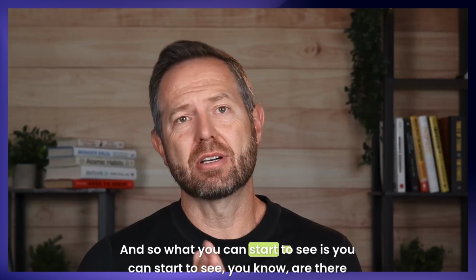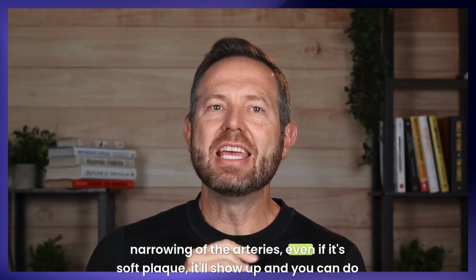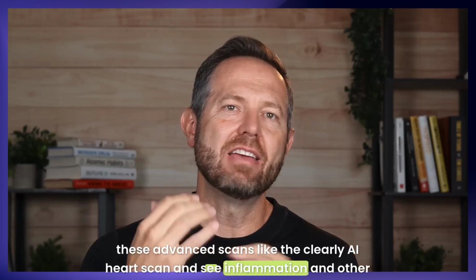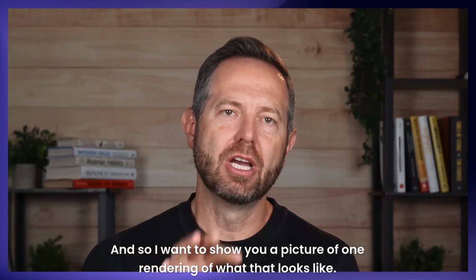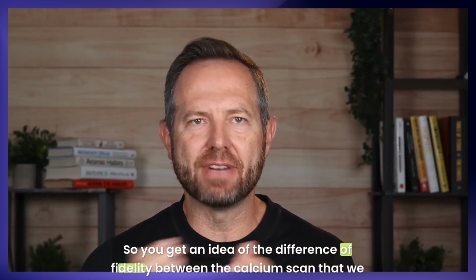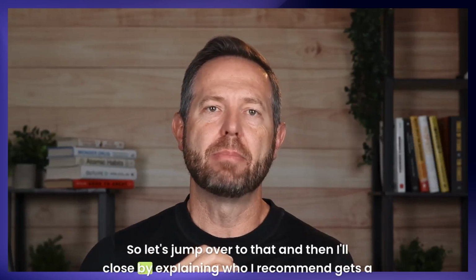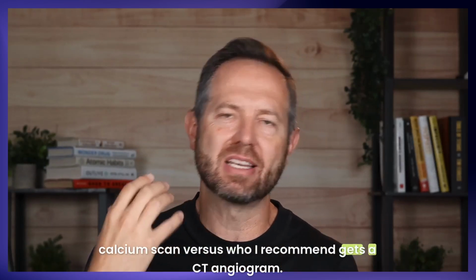And so what you can start to see is, are there narrowings of the arteries? Even if it's soft plaque, it'll show up. And you can do these advanced scans like the Clearly AI heart scan and see inflammation and other soft plaques in the heart. And so I want to show you a picture of one rendering of what that looks like, so you get an idea of the difference of fidelity between the calcium scan that we already looked at and now CT angiogram. So let's jump over to that, and then I'll close by explaining who I recommend gets a calcium scan versus who I recommend gets a CT angiogram.